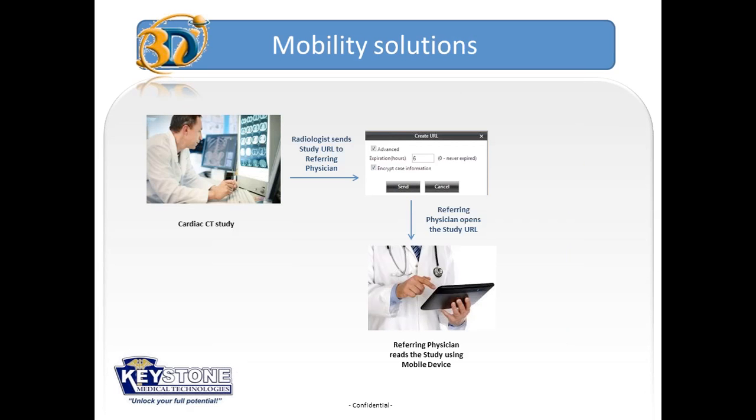And that referring physician, again, is usually a moving target, sometimes at one location one day, another location another day, etc. And with the popularity of iPads, iPhones, basically smart mobile devices, we have the ability to let the physician stay on the go, be more efficient in his or her workflow, and still review quality diagnostic images.